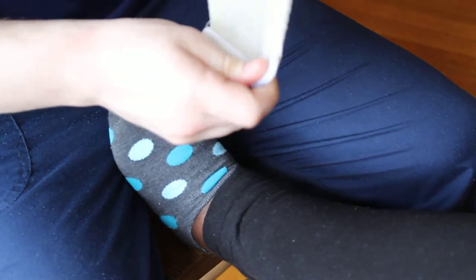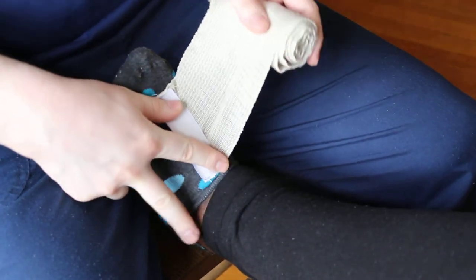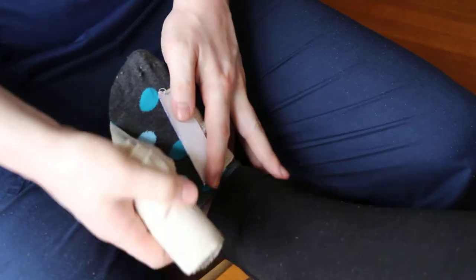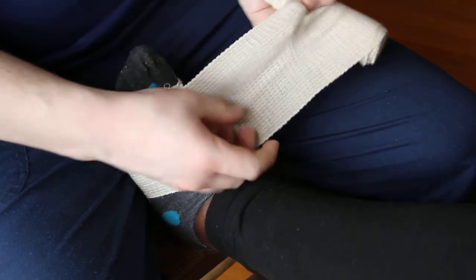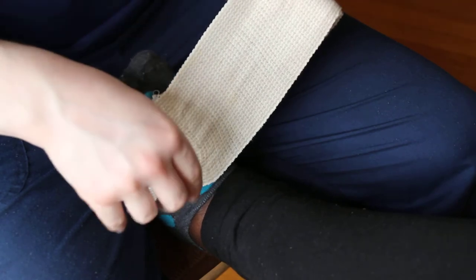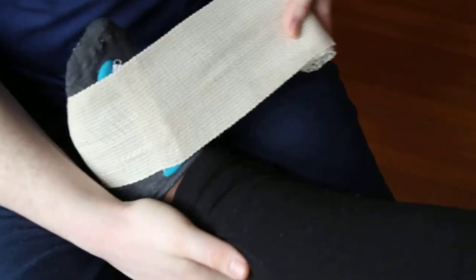When you begin your cross pattern, you're going to start out with the Velcro face up on the bridge of the foot. Go around the foot once, kind of pull it a little bit tight but not too tight. Make sure you lock in that first rotation so that it kind of locks in each rep.